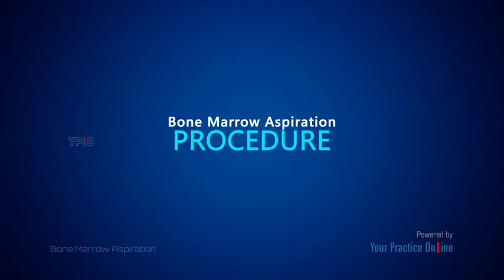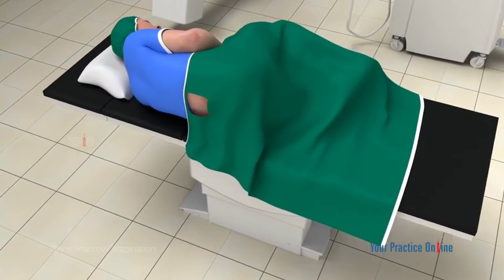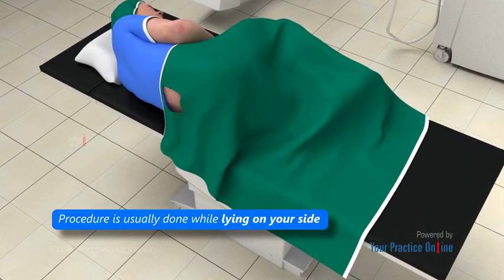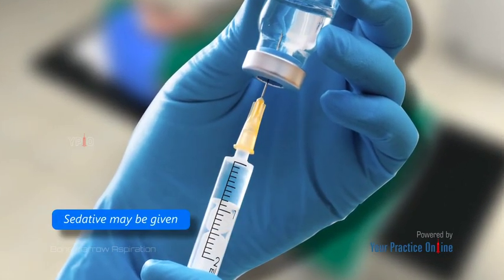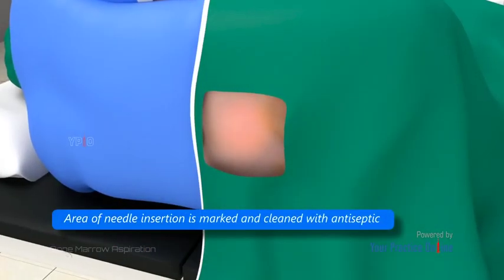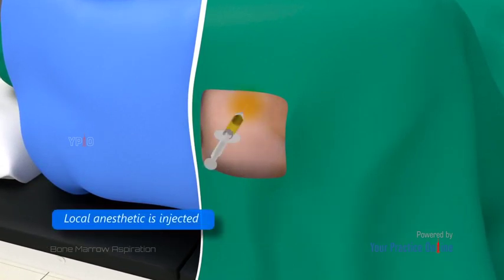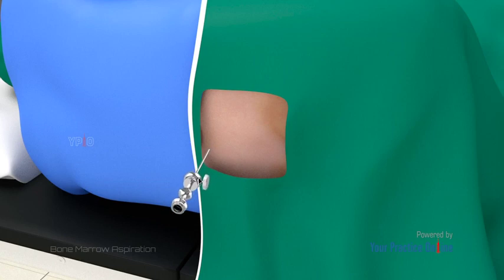Bone marrow aspiration procedure. The bone marrow aspiration procedure involves the following steps. The procedure is usually done while lying on your side. A sedative may be given prior to the procedure to help you relax. The area of needle insertion is marked and cleaned with an antiseptic. A local anesthetic is injected to numb the aspiration site. A needle is inserted through the skin and into the bone marrow. A syringe is then used to draw out the liquid bone marrow.